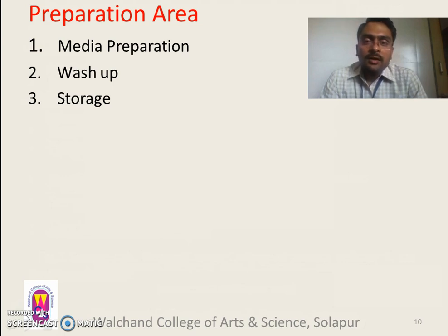It is easy for us if a synthetic medium is readily available commercially, in which case it is used. If it is not available commercially, then you have to prepare a stock of the medium sufficient for the complete course of animal tissue culture.